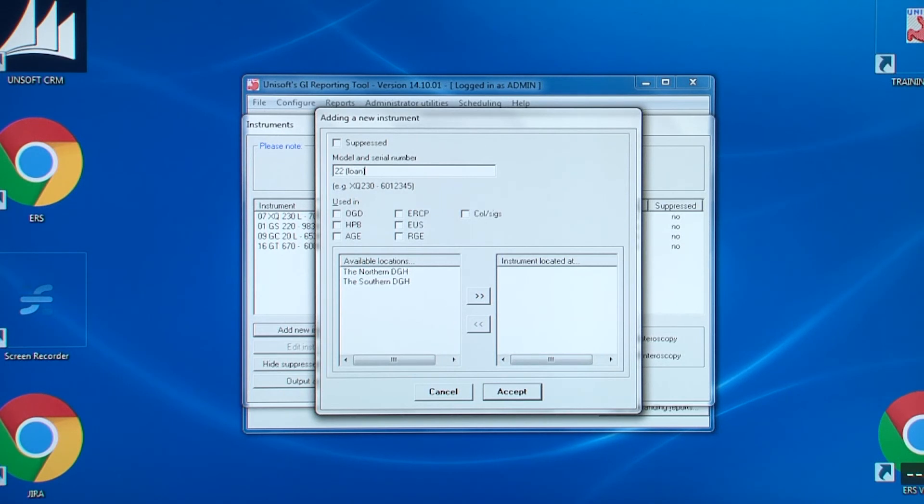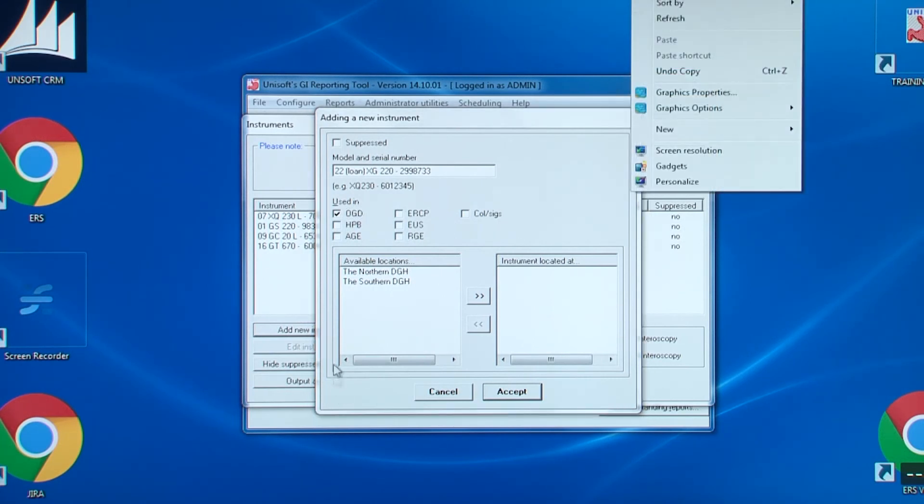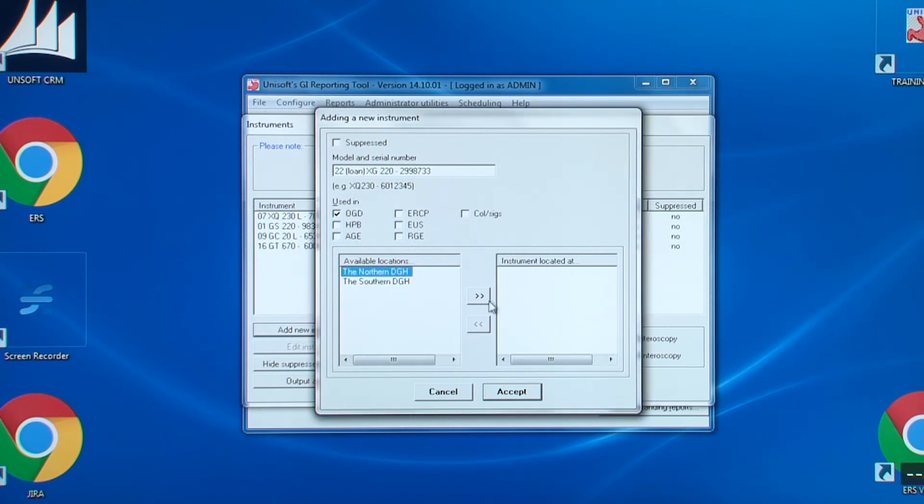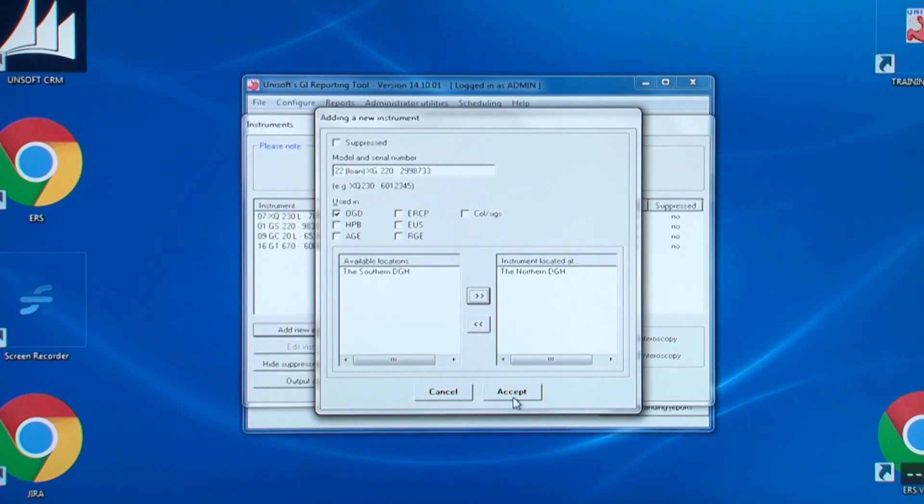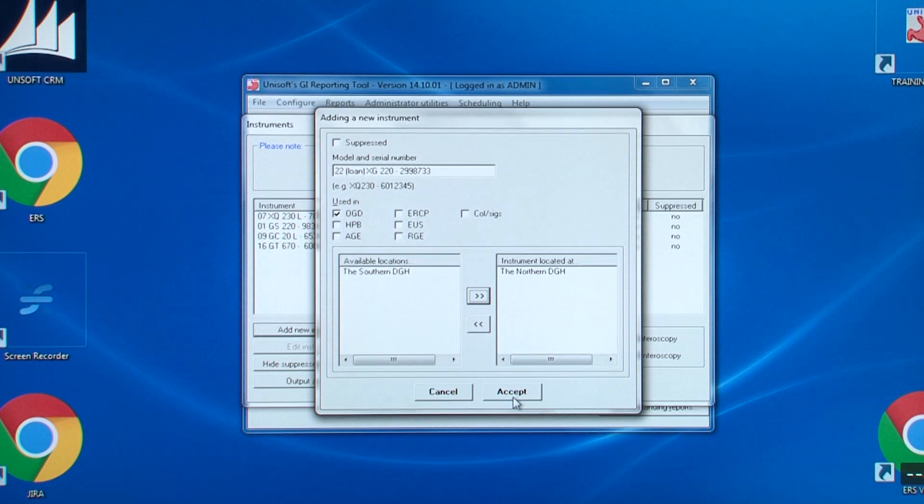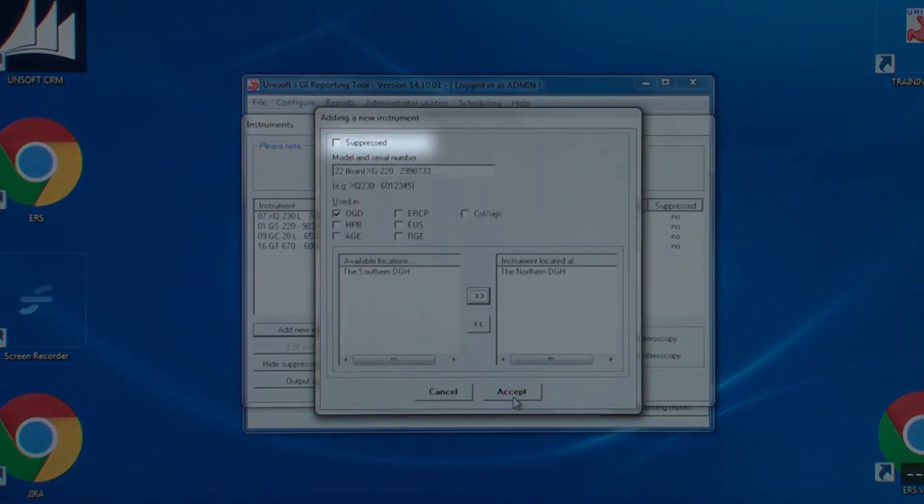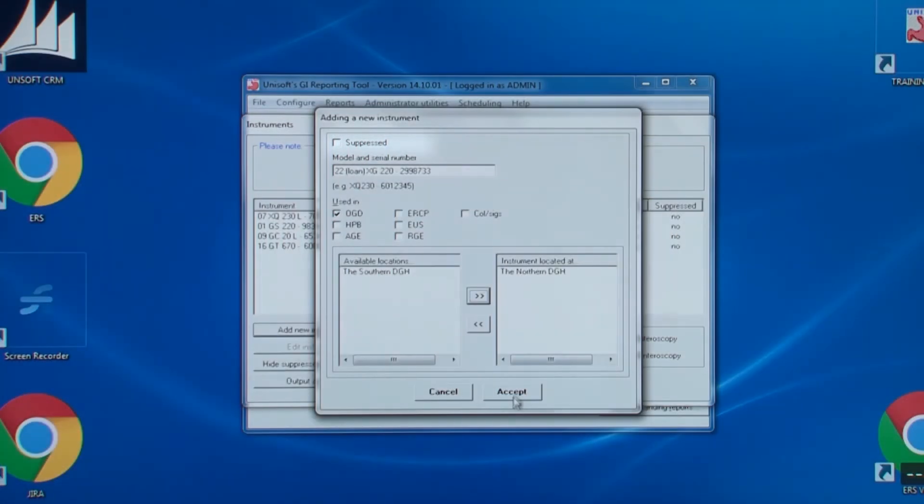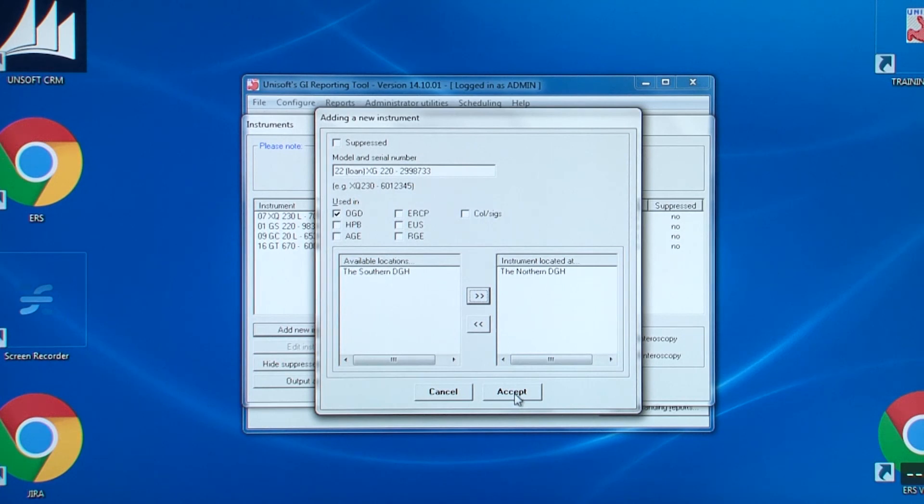Even do this for loan scopes, so let's add one now. Here, the word loan is being added in brackets after the unique identifier. Also shown is this is for OGDs and is only available at this one hospital. Then click accept. If a scope is no longer used, then edit it and it can be suppressed from appearing in future dropdown lists.